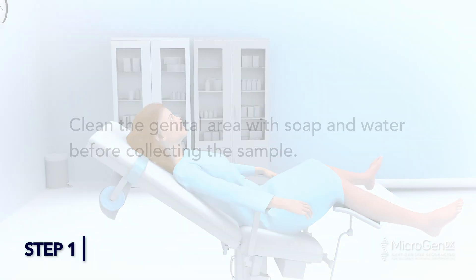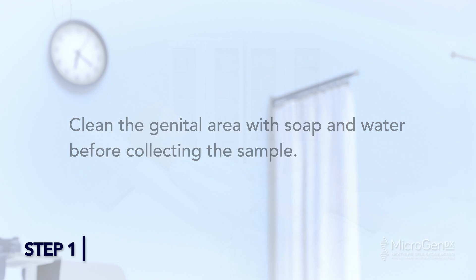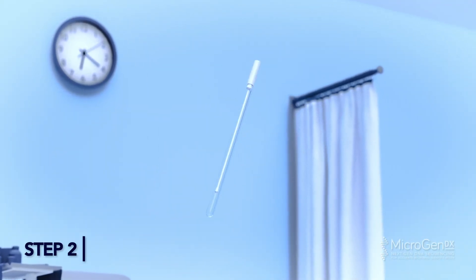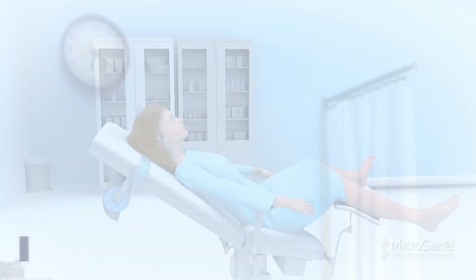Step 1: Clean the genital area with soap and water before collecting the sample. Step 2: Twist the cap at the dotted line to break the seal. Remove the swab completely from the tube, not letting your hands touch the swab beyond the break point.